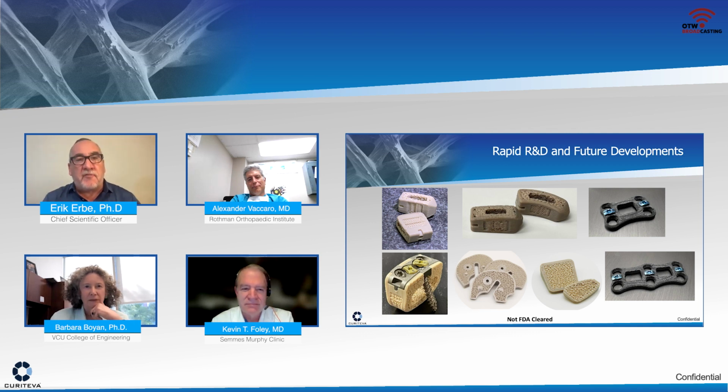You can see PLIF, T-lifts. We've got larger implants. We're in the process of printing standalone ALIF. You see some plates that we've played around with there on the right. And this biologic incorporation, if you will, we can print different pore structures. And indeed, structure does drive biology. And in those lower middle sections, you can see tibial plateau and then Cotton and Evans foot and ankle wedges.